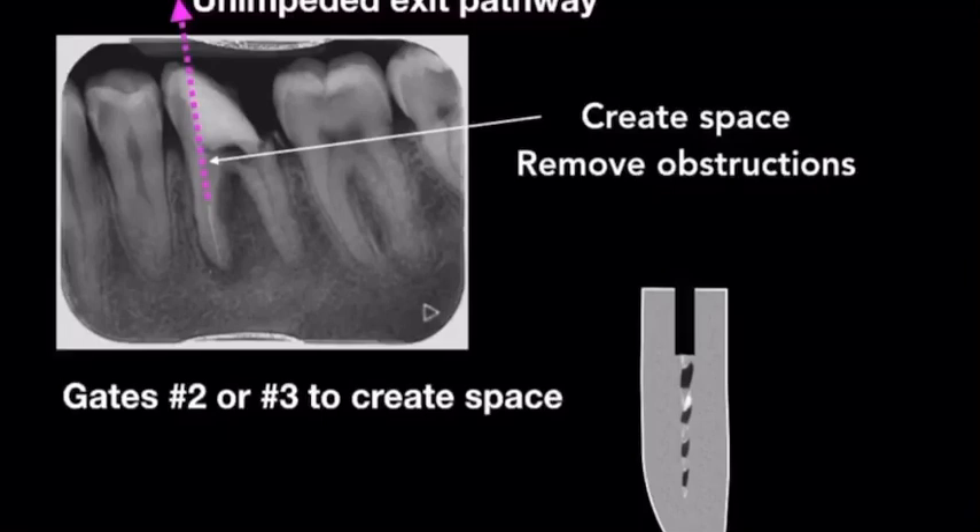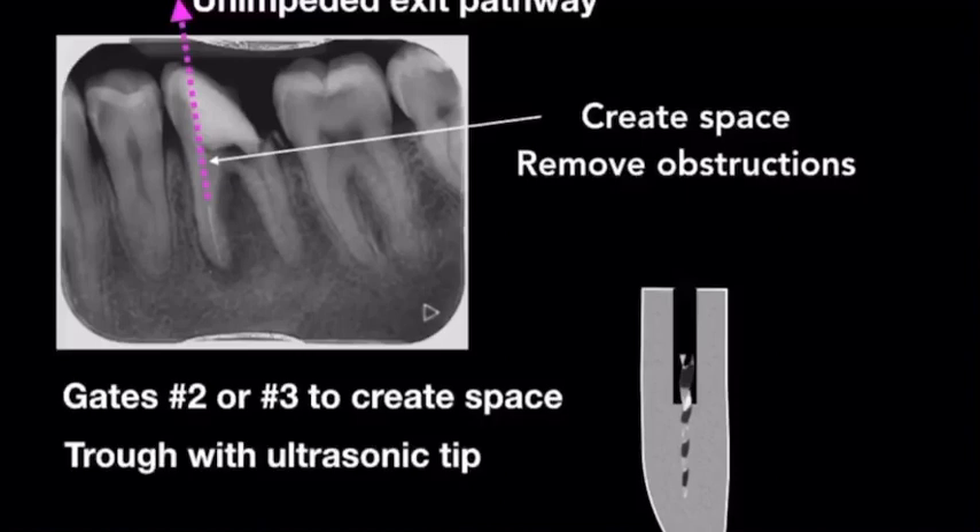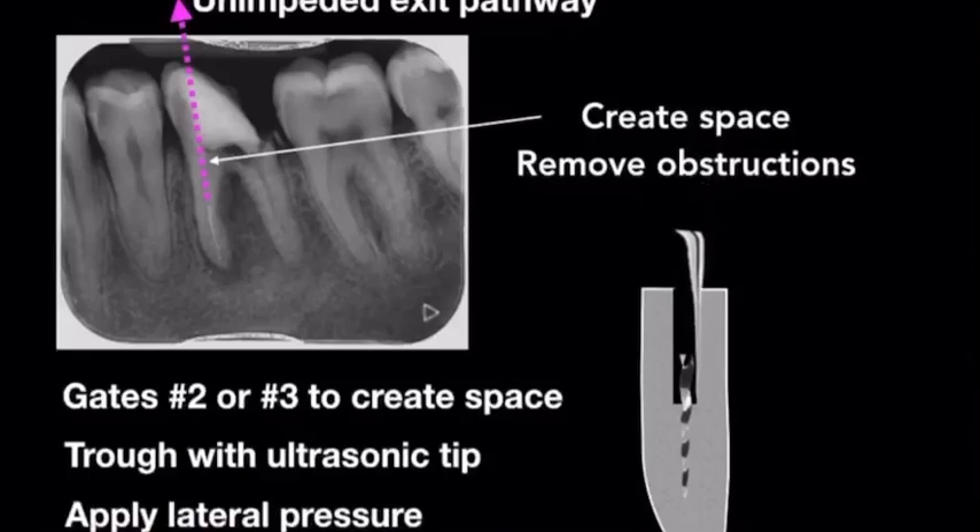Once we've achieved a staging platform over the head of the instrument, we can then trough around it with an ultrasonic tip. And finally, applying lateral pressure to the piece of broken file, we will hopefully retrieve it.